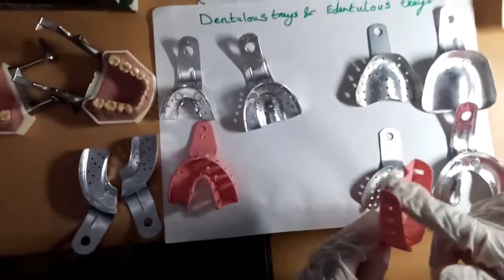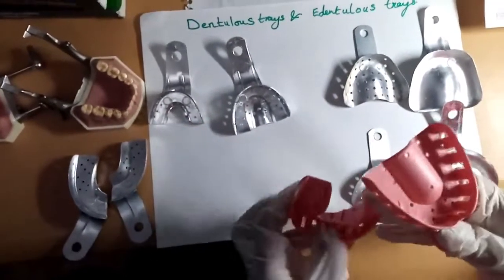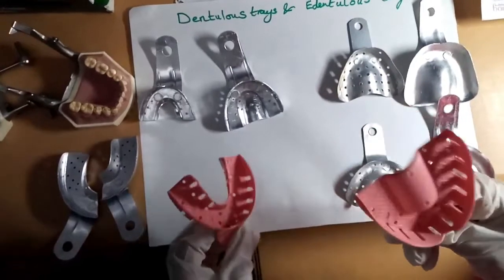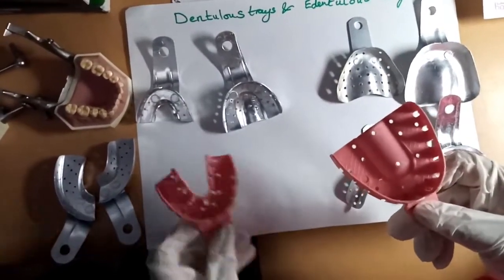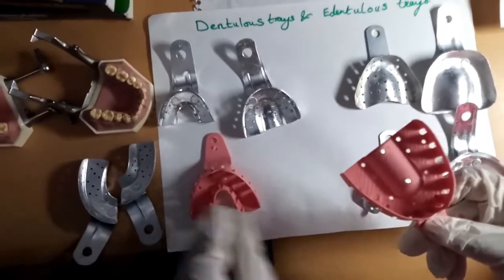So this is the impression tray. We have the upper impression tray and we have the lower impression tray. Can you see the difference? They are different in shape. So this is the upper impression tray and this is the lower impression tray. Let's talk about the parts of the impression tray.